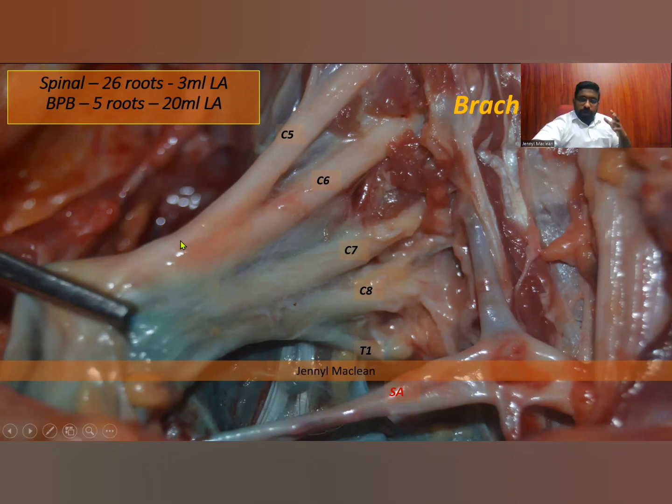So if you want a spinal anesthesia of the arm, you need to breach these connective tissues and perfectly place the desired drug at the right sweet spot of the nerve, which I call the paraneural space. Then you will get the faster onset, just like spinal anesthesia, and you call it spinal anesthesia of the arm.